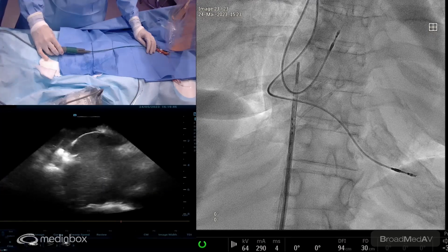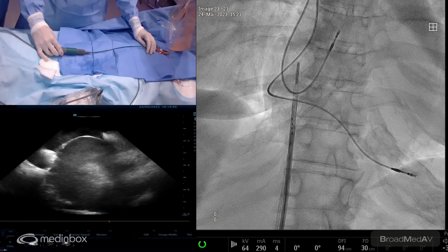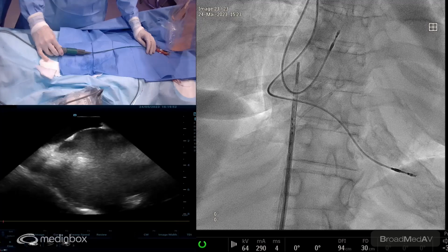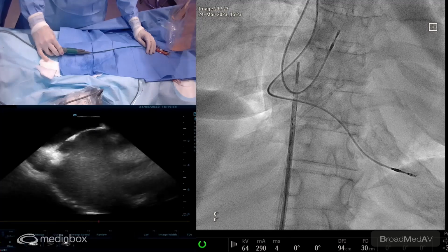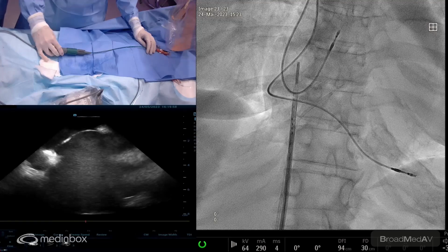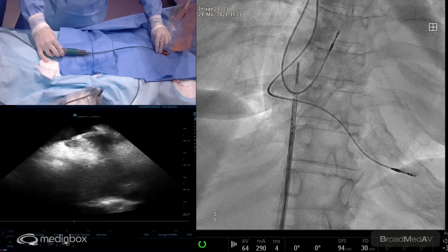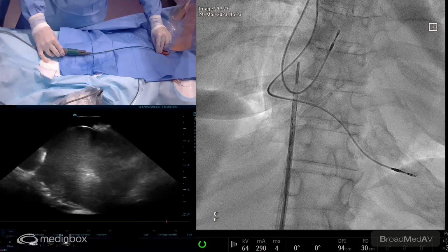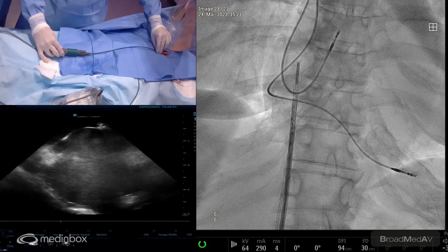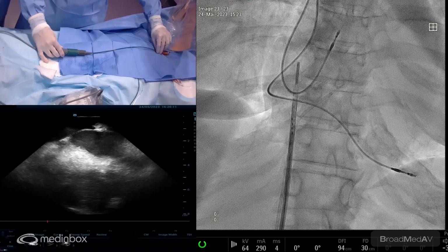So you see well the atrial septum. There are two parts: a thin part that we call the septum primum, and a thicker part on the right side, roughly at 1 o'clock here, that we call the septum secundum. The foramen is in between the two septa. So this is more a pathway, a tunnel in between the two septa that we see here quite well.